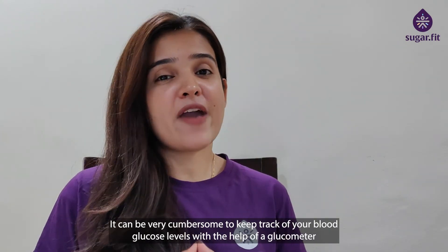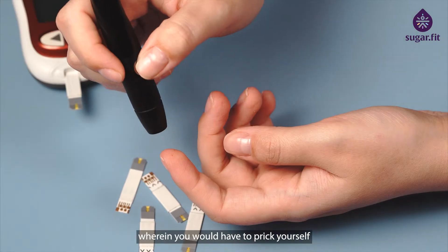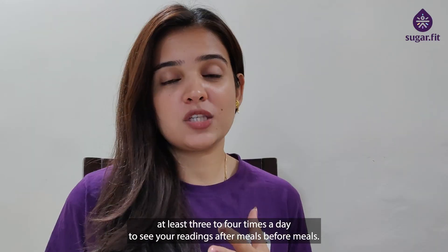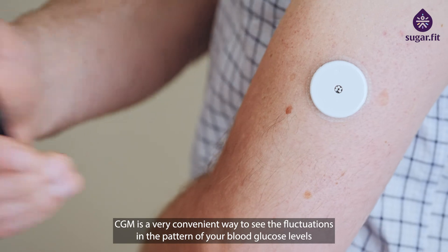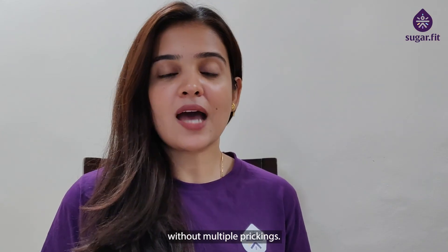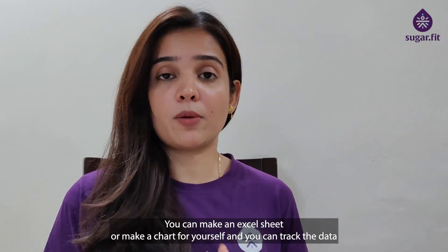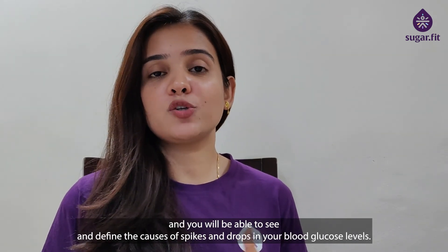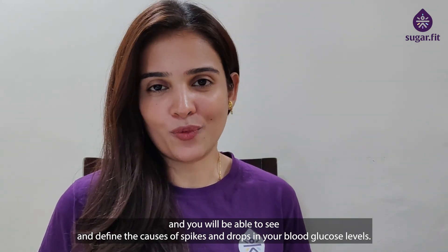It can be very cumbersome to keep track of blood glucose levels with a glucometer, where you would have to prick yourself at least three to four times a day to see your readings after and before meals. CGM is a very convenient way to see the fluctuations and the pattern in your blood glucose levels without multiple prickings. You can make an Excel sheet or a chart and track the data to define the causes of spikes and drops in your blood glucose levels.